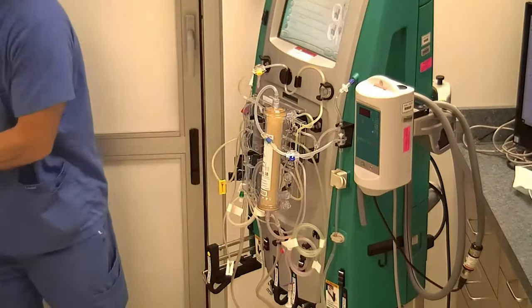And again, we don't have to clamp this line. We're just going to go ahead and spike it. Remember to push your scale in, make sure the tubing is not in the way. Push in your scale and hear it click. And as you go down the line, the next step is to connect the dialysate line. It shows a green line on the computer. So you're going to find the green tubing. We're going to take our other bag of saline. Let's switch this side real fast. Now we're pushing our scale. We're going to hear it click.